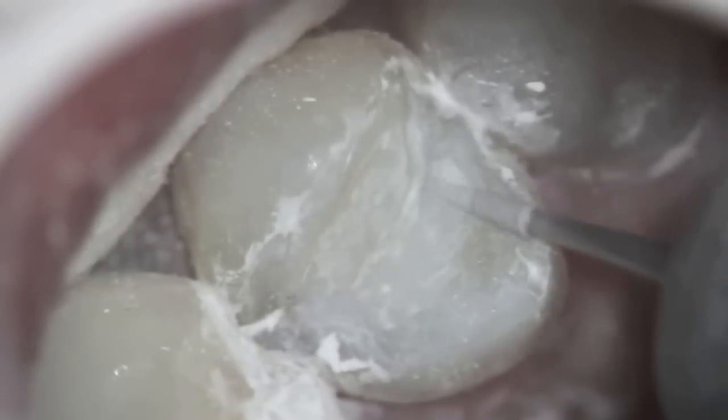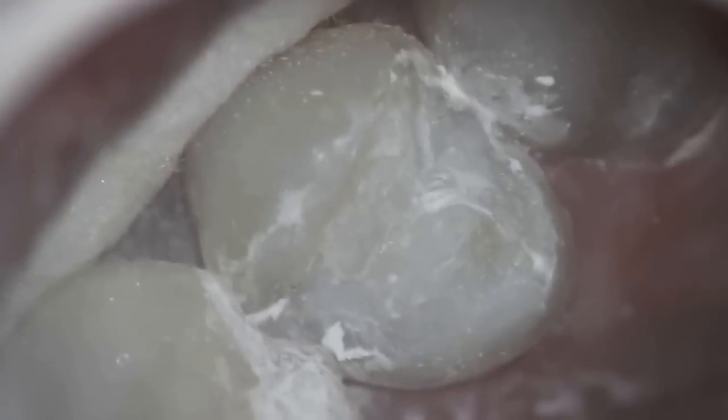With this sort of polishing and carving, we know the filling is not going to last for a long period of time, and we're going to come back and do a crown on it, leaving some of the filling behind because it is a buildup. But this outer aspect will be removed, and we're basically just carving it to look like a tooth and to make sure that the occlusion is proper.